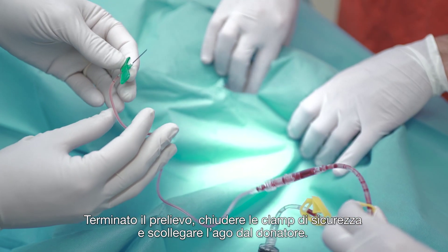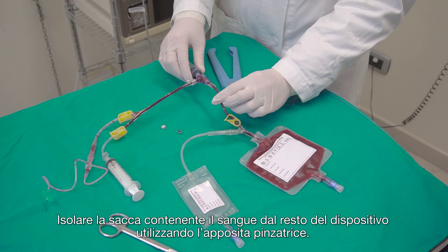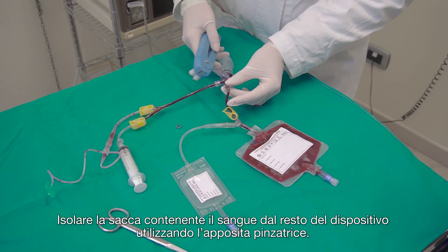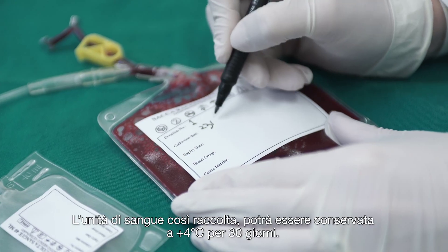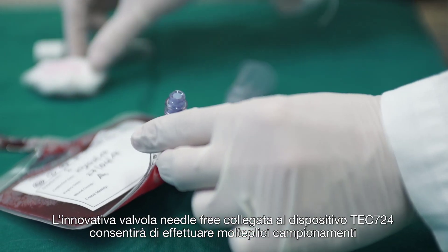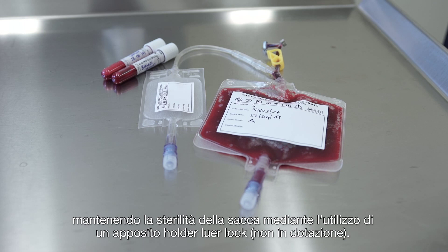Once the withdrawal is finished, close the security clamp and remove the needle from the donor. Separate the bag containing the blood from the device by means of a tube stripper. The unit of blood can be stored at plus 4 degrees Celsius for 30 days. The innovative needle-free valve connected to the system allows sterile blood sampling by using a dedicated luer lock holder, not included.